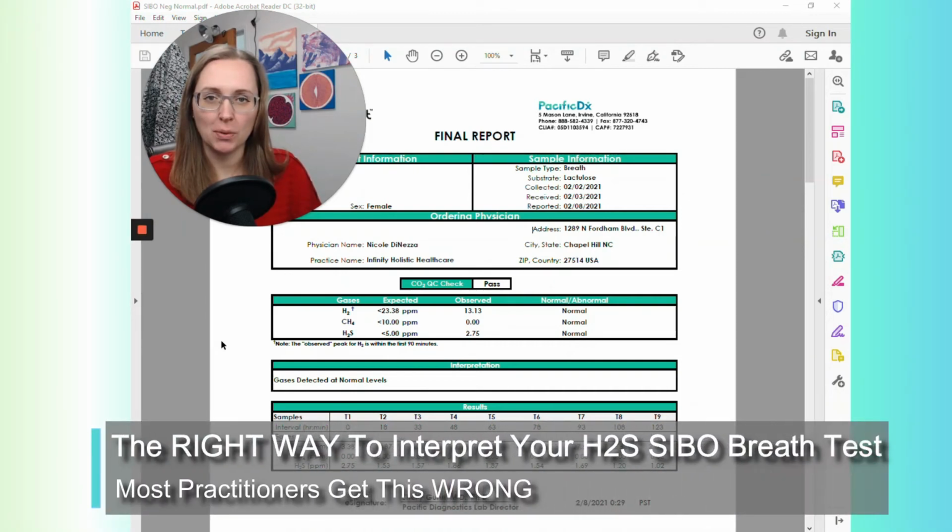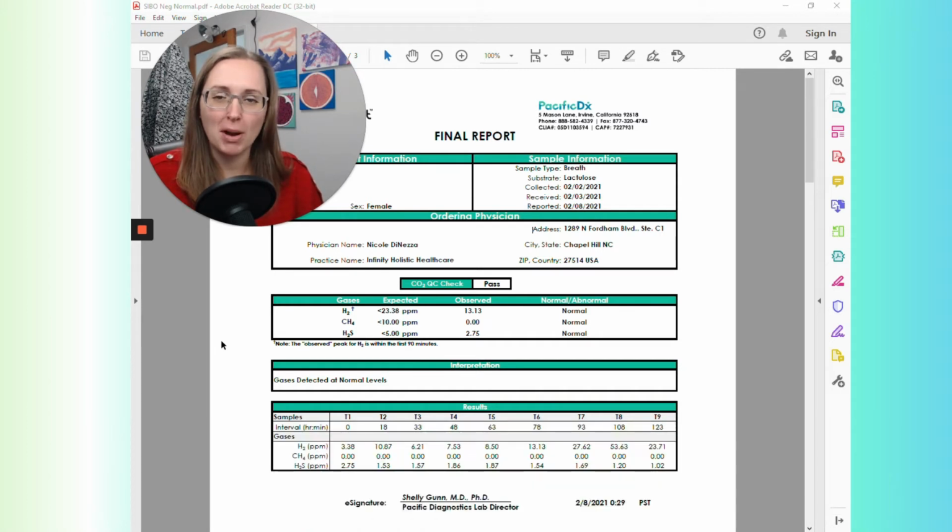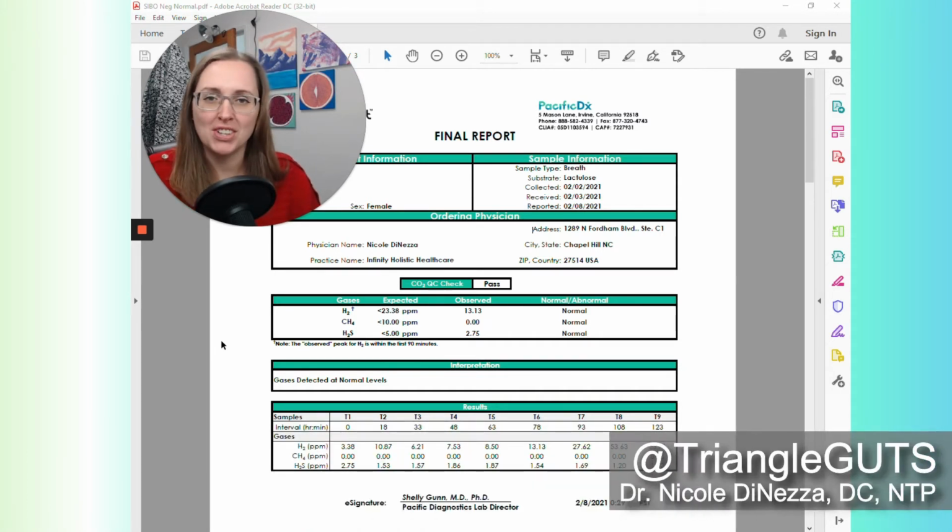Today I'm going to show you how to interpret a SIBO breath test, and particularly I'm going to be focusing on the Trio Smart breath test. Now for those of you who don't know, or maybe you're not in the United States, this is brand new, hot off the press. It's only been available for about 6 months, and this is the first and only breath test that measures hydrogen sulfide, the elusive third SIBO gas. So if you have been wondering if you have hydrogen sulfide SIBO and that's been tossed around or suggested to you, this is the test that you might want to consider.